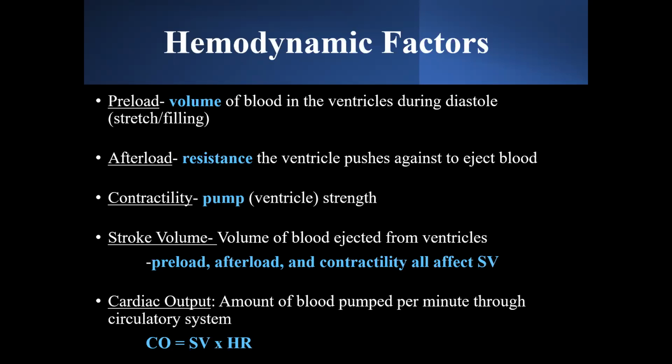And that's from Stephanie's other page that has the big boxes that say cardiac output, cardiac index. Okay, we report them in liters, but you have to calculate them and convert them from milliliters to liters.